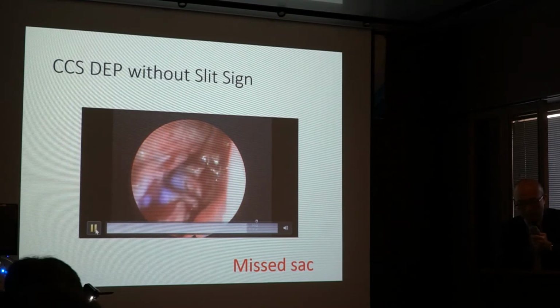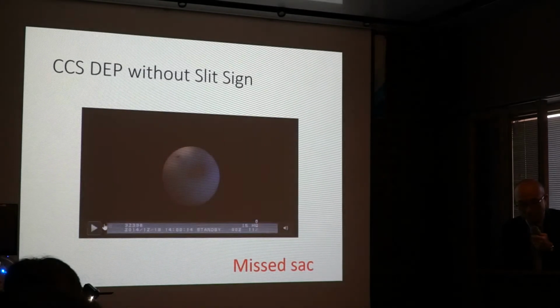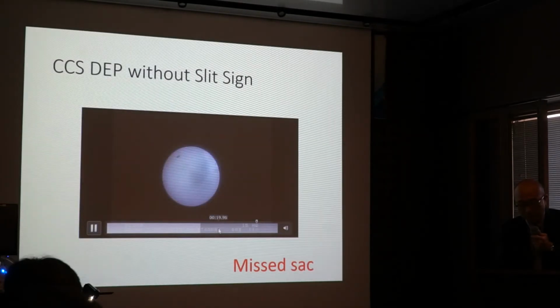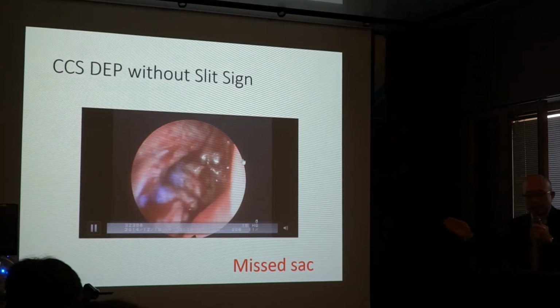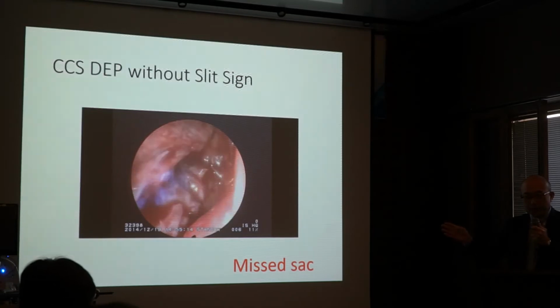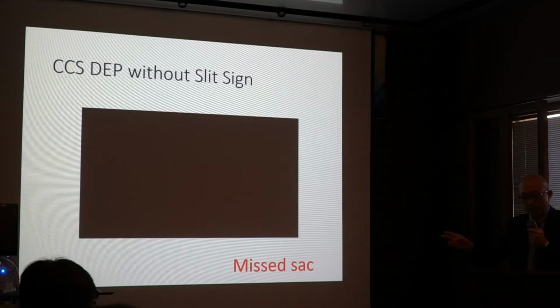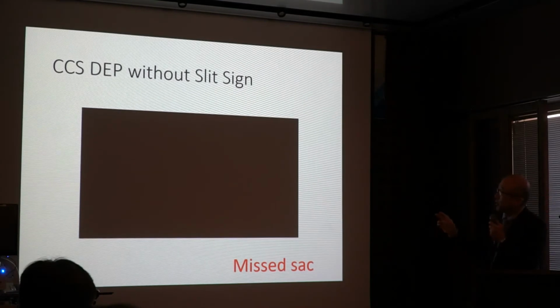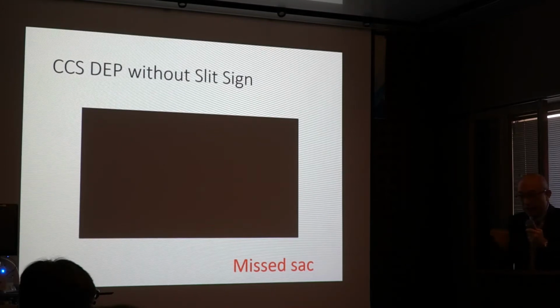And surprisingly, the illumination of the fiber scope can be seen like this. So this is great evidence that the lacrimal endoscope is migrating into the lacrimal sac wall.